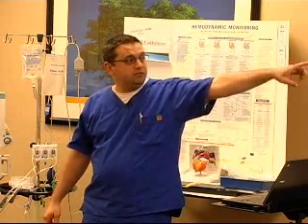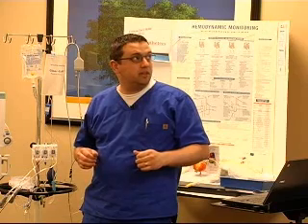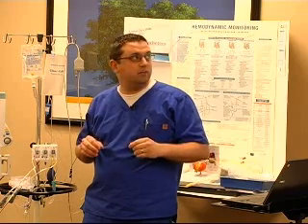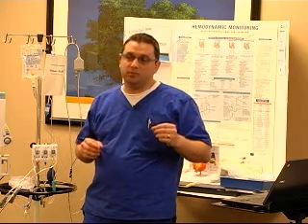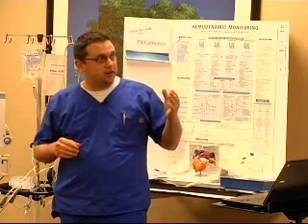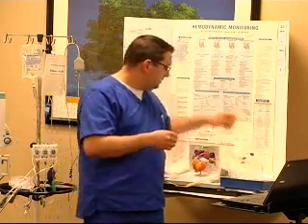And then once you get looped up through the valve into the PA, you're going to see the waveform change again. That's the ideal waveform that we want it to stay in at all times when we have the catheter in, when we're talking about the PA distal port. The next tracing is to make sure that it's in correct position, which would be the wedge tracing. When you think about the pulmonary arteries, they're progressively tapered. We're going to watch that balloon wedge into that pulmonary artery.